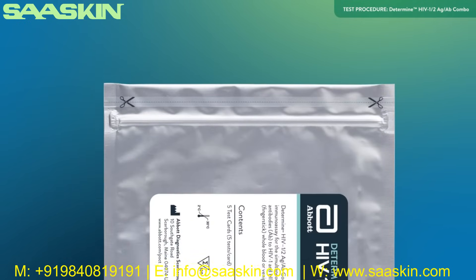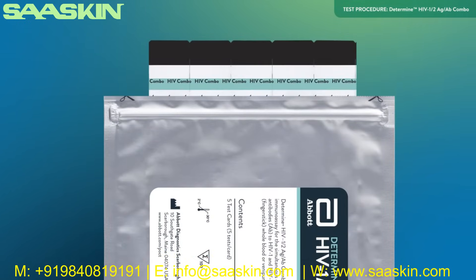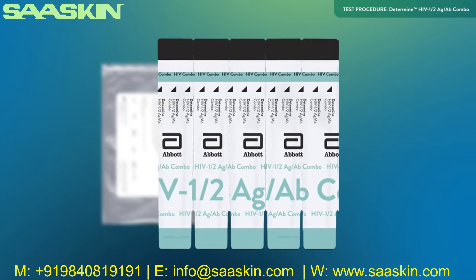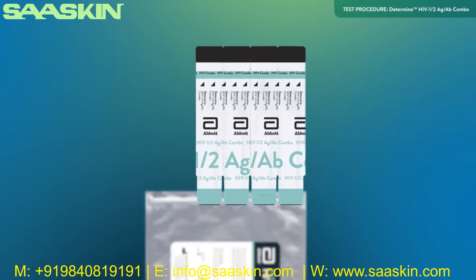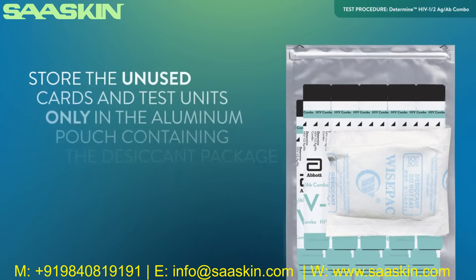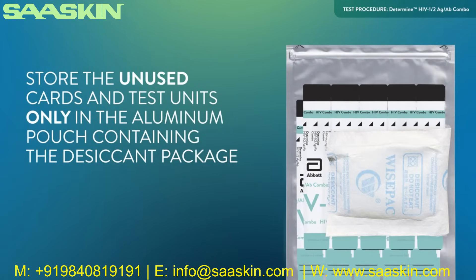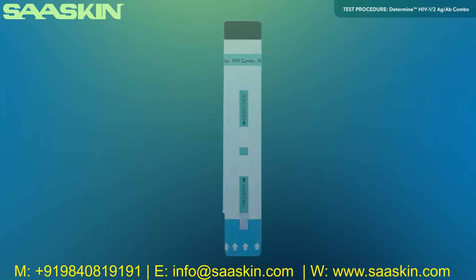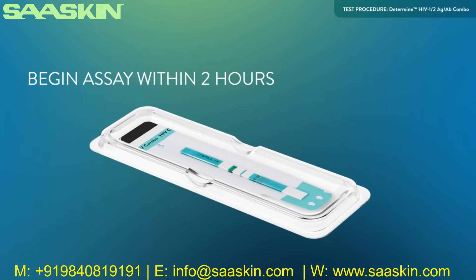Test Preparation. Open the aluminum Ziploc pouch containing the Determine HIV-1-2 Antigen-Antibody Combo test cards. Remove the desired number of test units from the 5-test unit card by bending and tearing at the perforation. Return the unused test units to the aluminum pouch and carefully close the Ziploc so that the cards are not exposed to ambient humidity during storage. Store the unused cards and test units only in the aluminum pouch containing the desiccant package. Remove the protective foil cover from each test unit, and lay the test unit flat in the disposable workstation. The test should be initiated within 2 hours after removing the protective foil cover.